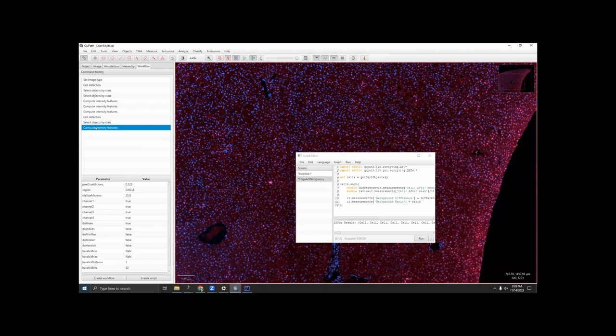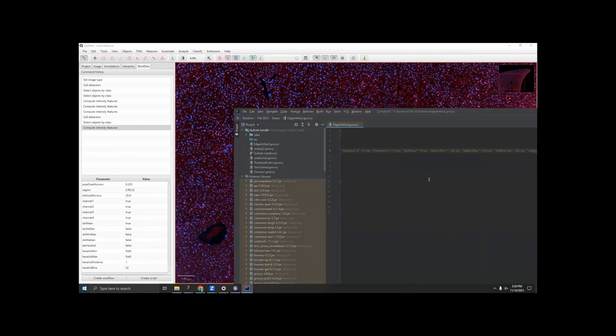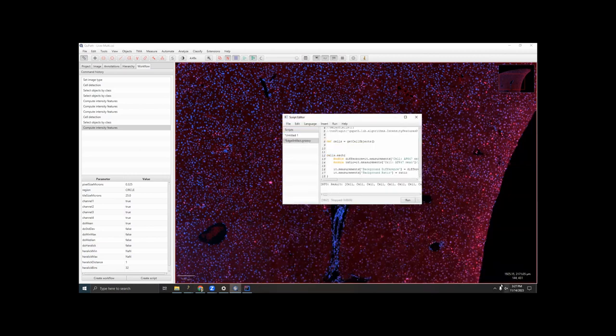And then do the same thing with computing the intensity features in the circular tile. So I have that. Since I already did it and I don't want to accidentally rerun the calculation of intensity features because it takes a long time, I'm going to just comment it out, but at least I know it's there, and this way I always know that I wanted a 25 micron circle with 0.33 micron pixel size. By the way, as soon as you save in IntelliJ, it just automatically updates inside the QuPath script editor. They're linked.